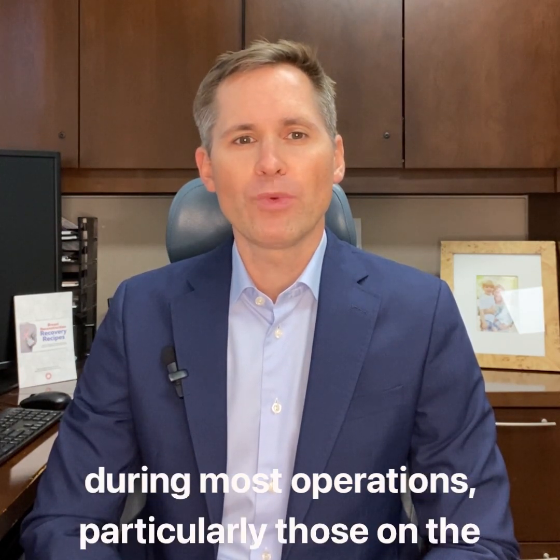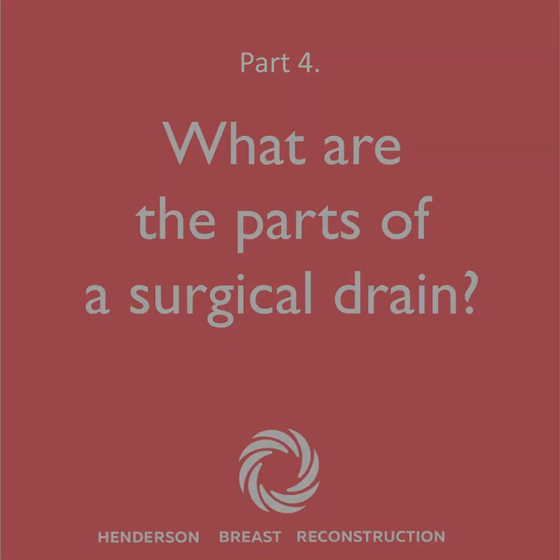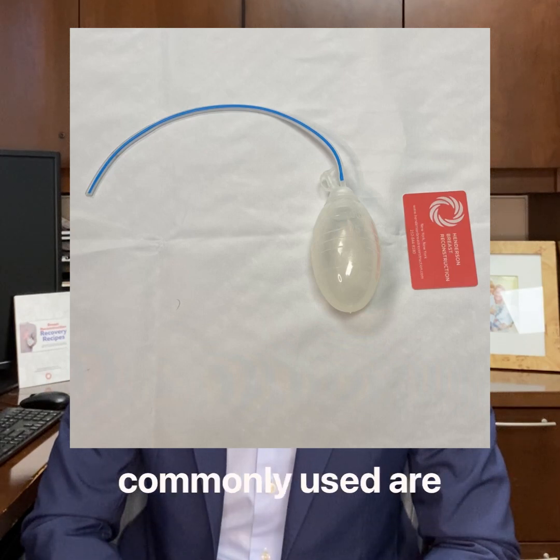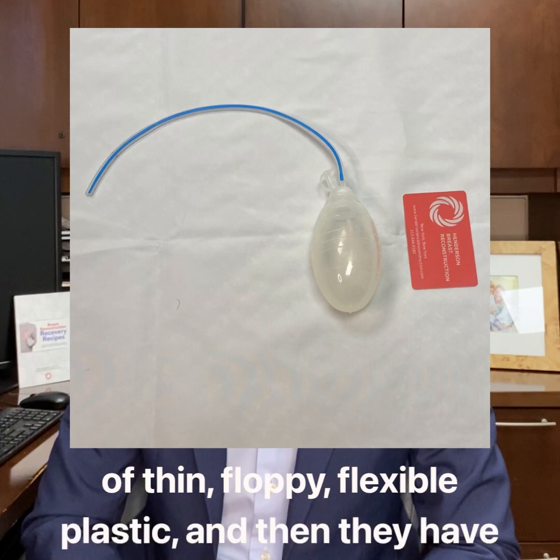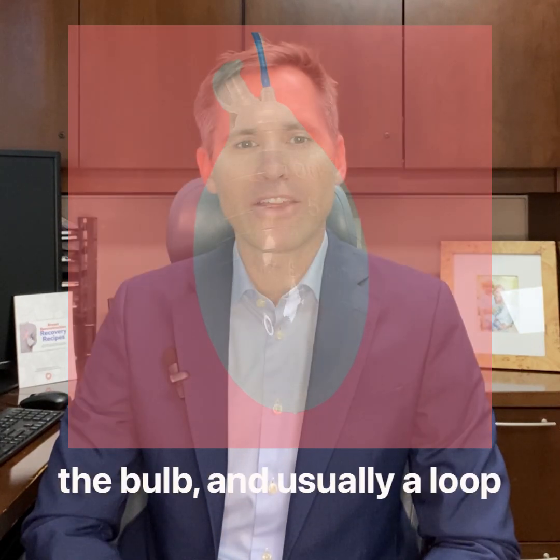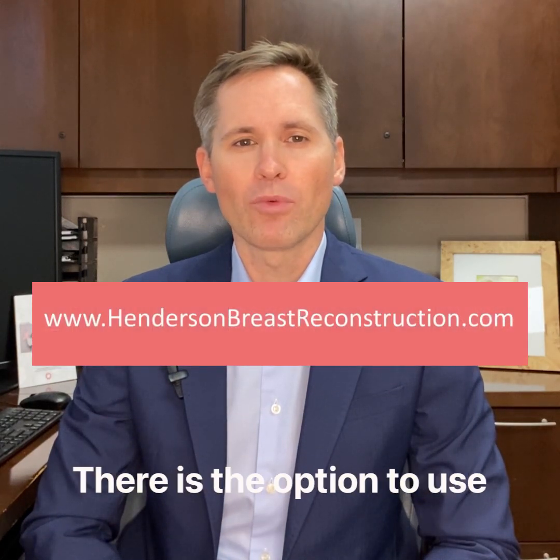They usually stay in for one or two weeks, and then they are removed in the office. The drains we most commonly use are comprised of a narrow tube of thin, floppy, flexible plastic, and then they have a collection bulb on the end that looks a lot like a grenade. There is a cap on the top of the bulb, and usually a loop or clip that allows it to be connected to your clothing so that it doesn't dangle.